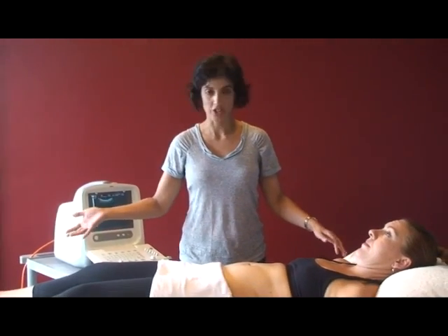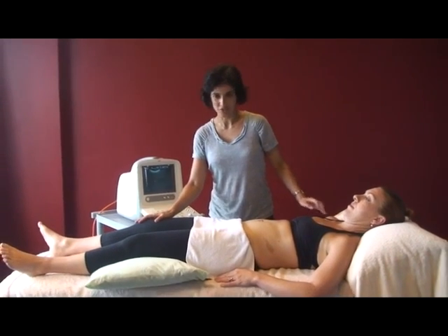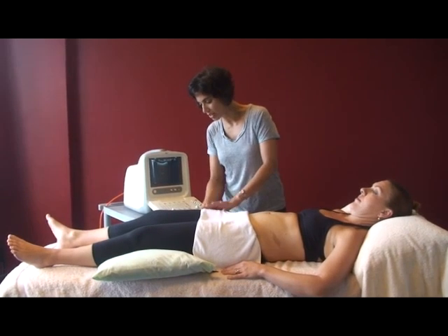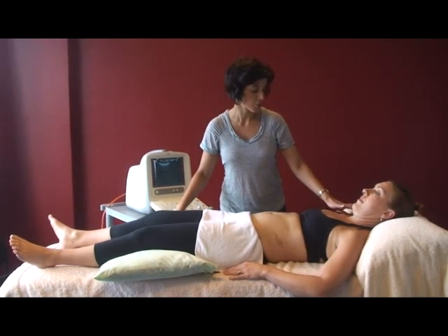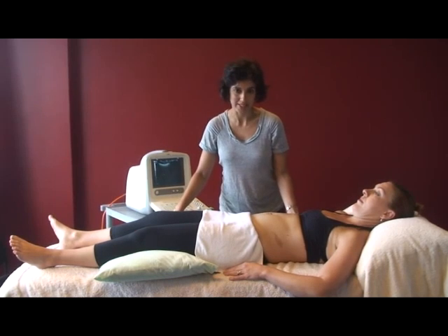The initial assessment involves using the real-time ultrasound to assess the pelvic floor. First, we'll look at your client's position. You want to make sure their legs are nice and relaxed — their quads and glute max are all relaxed — so you can provide a pillow or two under their knees. You want to make sure their neck is relaxed, their chest is relaxed, and that they can breathe easily.